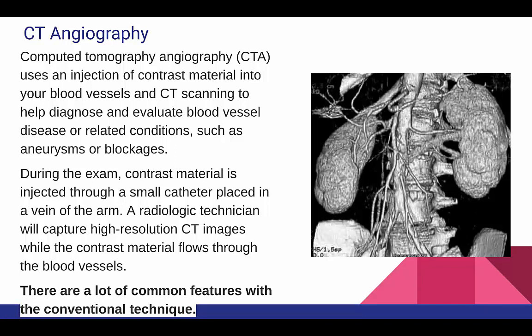In recent years, CT angiography is preferred more and more compared to the conventional technique. This is due to several reasons. One of the main ones is that CT angiography is less invasive compared to the conventional method.